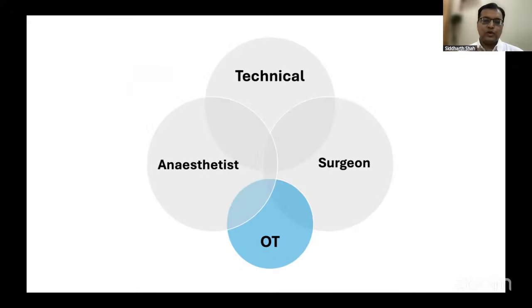It's not just for you to keep it to yourself. Every single person in the OT needs to know that we've had an alert and now we're going to do something differently. The surgery is now going to pause for a second, and there are different steps which are going to be taken. Those steps are going to be detailed down the line with Raj, who's going to go through the checklist. But we're going to run through how to communicate those steps.